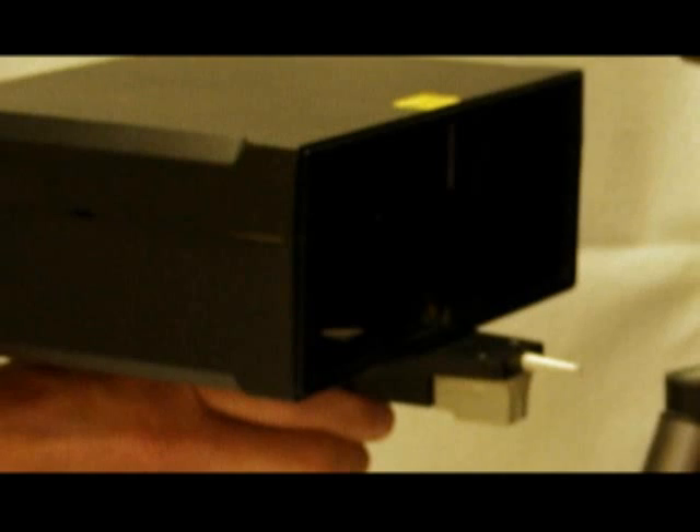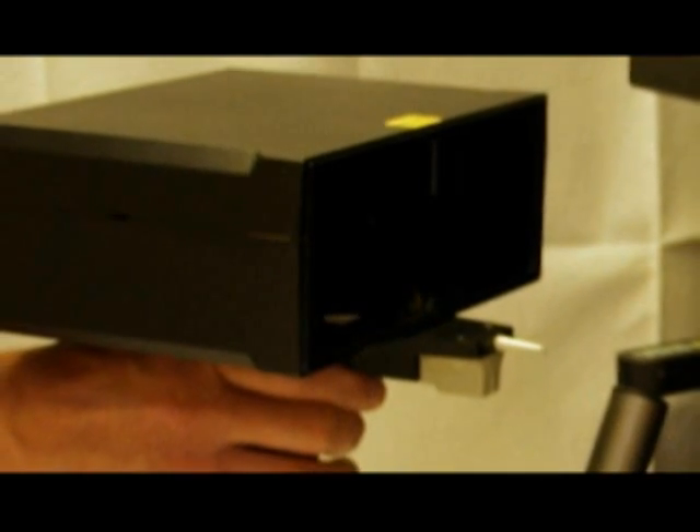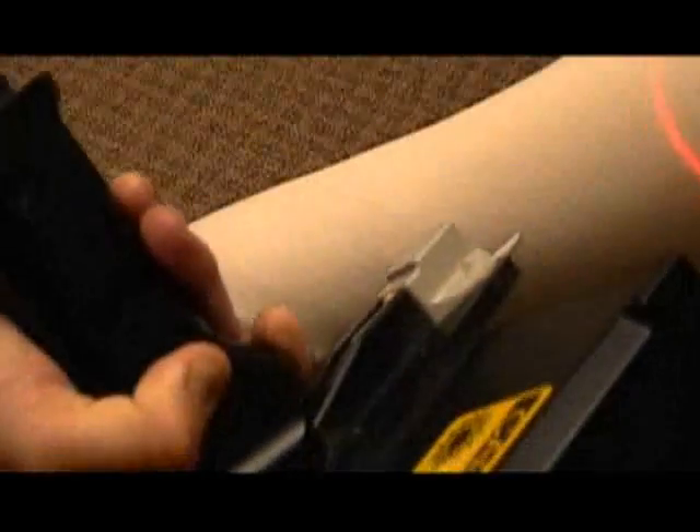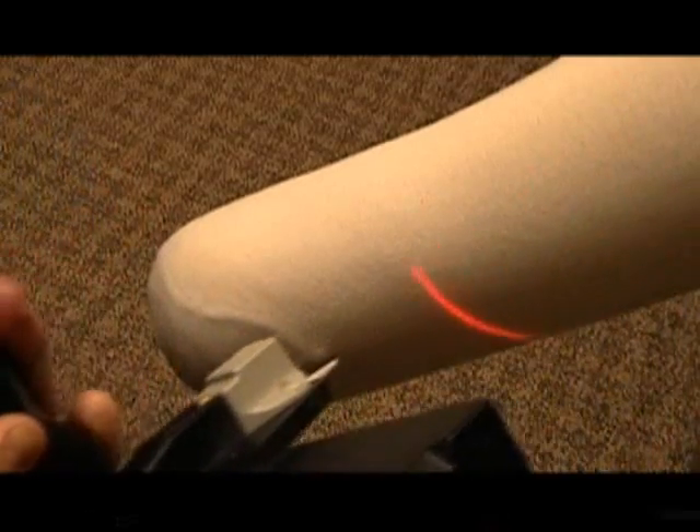The scanner is housed in a black box, and that black box is a computer and a camera — actually, two cameras, two eyes, just like you and I. Both cameras are seeing what your eyes see, but they're storing it digitally on the computer. It doesn't hurt. You don't feel anything. We're just painting with light.